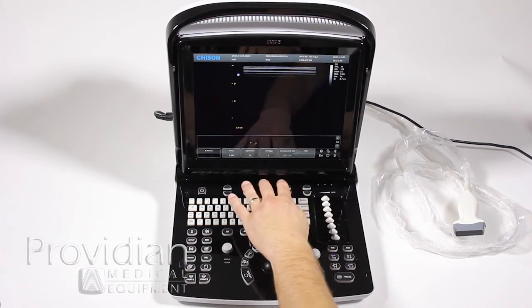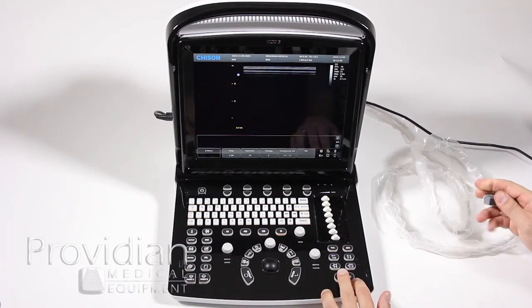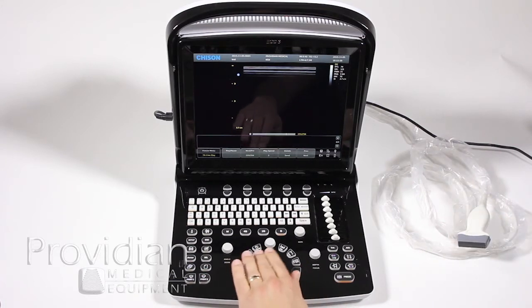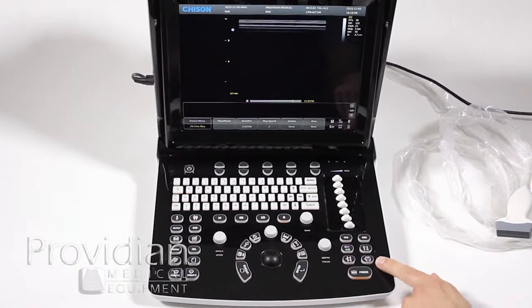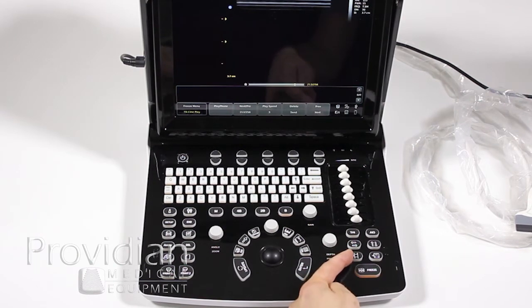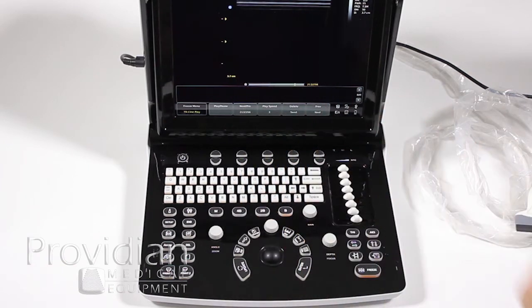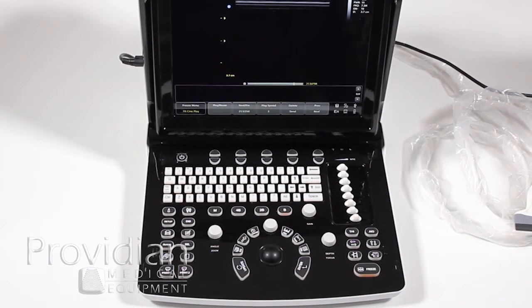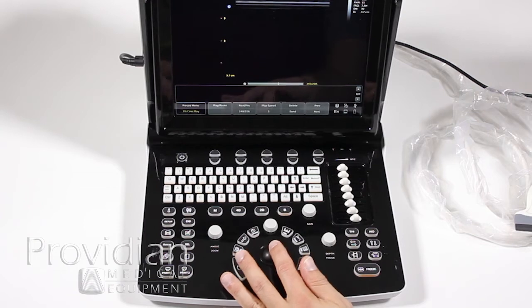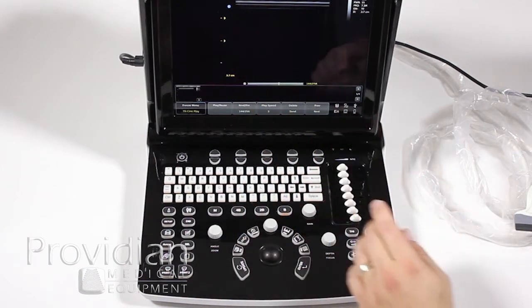Down below, we have frequency and other settings adjusted there. When most people get started, they want to know where the freeze key is. When you get your image, there's your freeze key — it goes immediately to Cine Review and you can scroll back through. This is also where you would save your clip. We have a single save key and a film strip save key that saves an entire loop. The snowflake icon means we're frozen. It shows the current frame — for example, 213 of 256 — meaning 256 frames are stored in memory and you can scroll through them. If you like an image, hit save and it saves that single image.